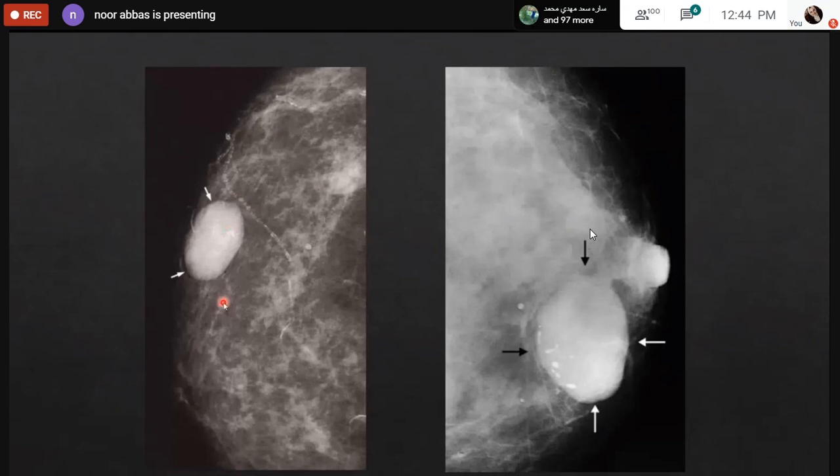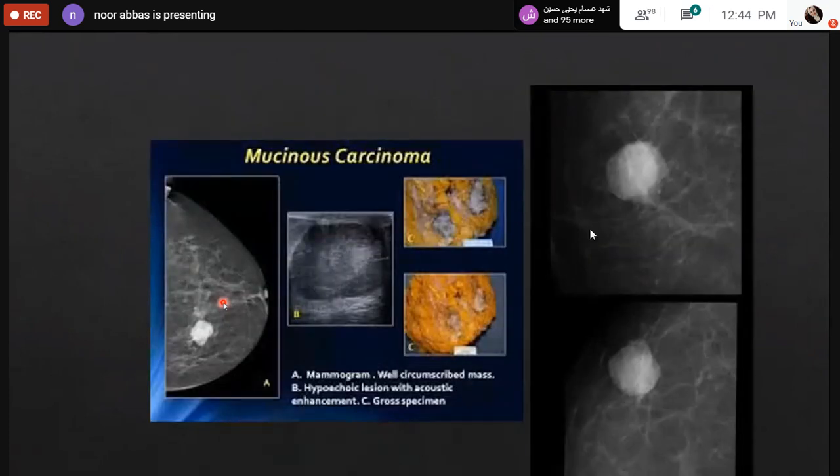لكن هذه نشوف المس will also examine by ultrasound, targeted ultrasound عليها، تأكد أنه هي بالultrasound كذلك harboring all the benign features. This is a benign mass. Okay. لكن ليش قلت لكم أنتوا هذه الأمور تعرفوها للمعرفة وليس للdiagnosis؟ لأنه الأمور not always gray and not always white and black. The gray spectrum is wide in breast.